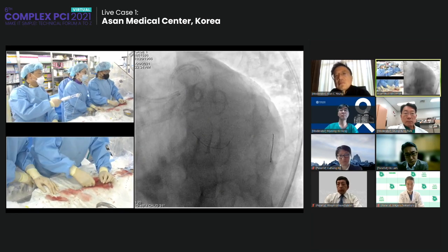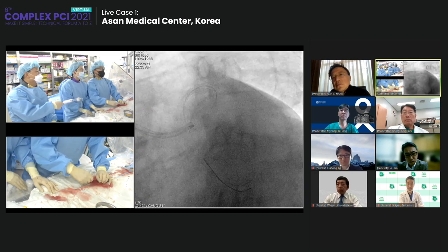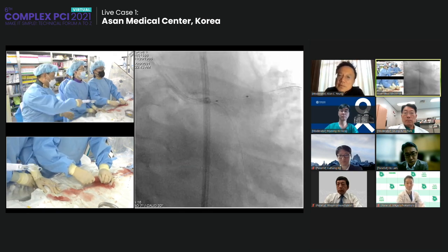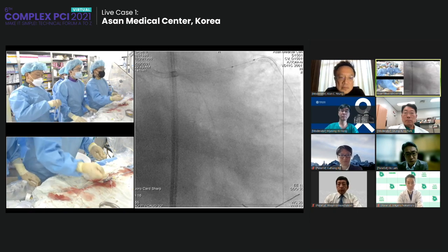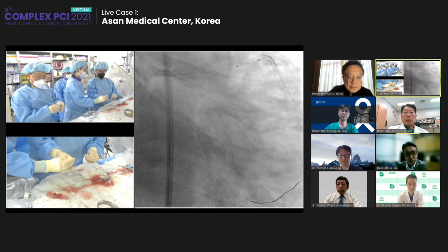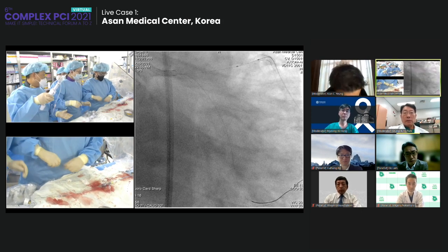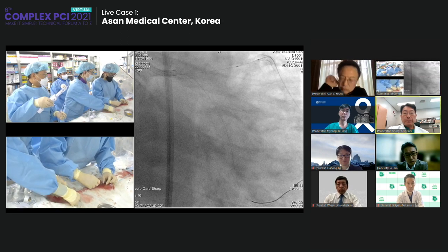Okay. So two zoom. Yes. Epicoda. Great. This is a 3.5 NC balloon. Okay. And then 28. Okay. Stent for the circumflex, you mean? Yes, right. All right, great. You don't need the predilation for that? Just the distal part we predilated, and this is just direct stenting.